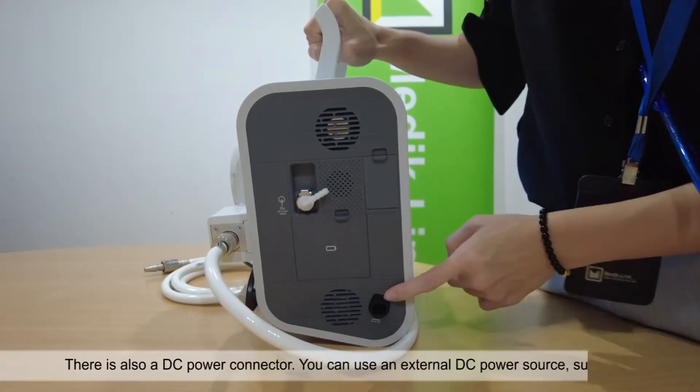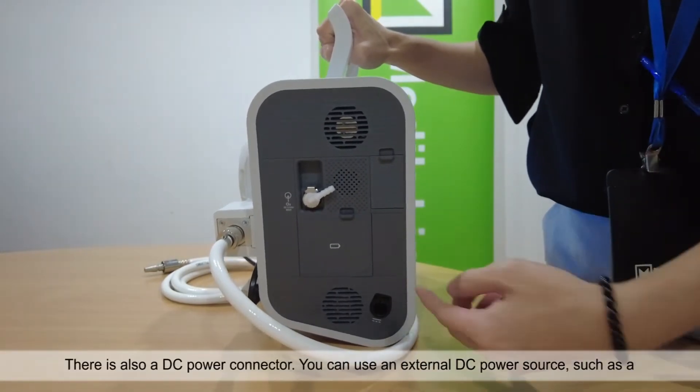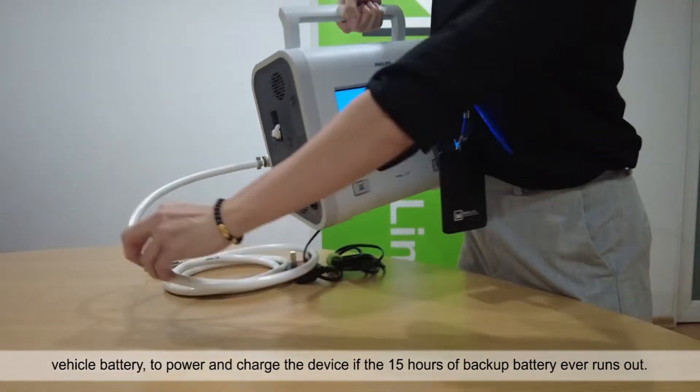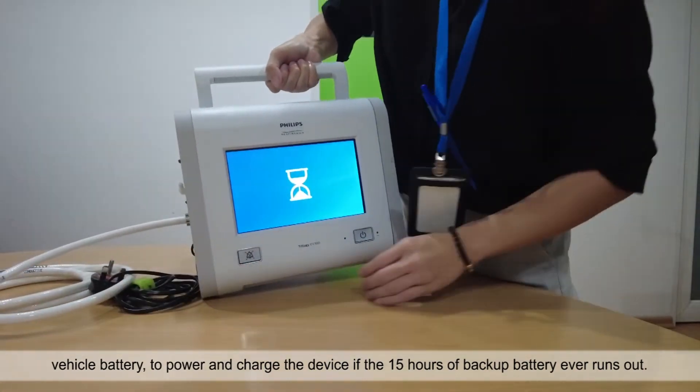There is also a DC power connector. You can use an external DC power source such as a vehicle battery to power and charge the device if the 15 hours of backup battery ever runs out.